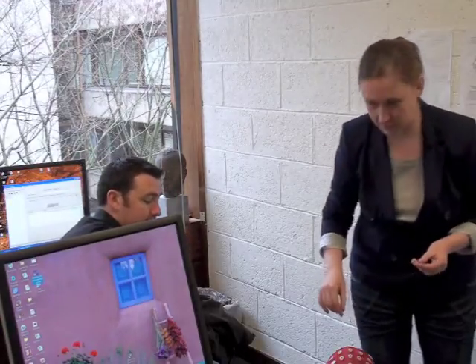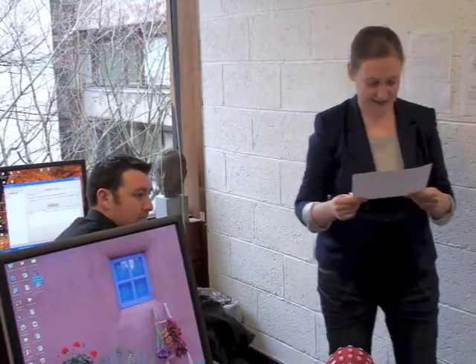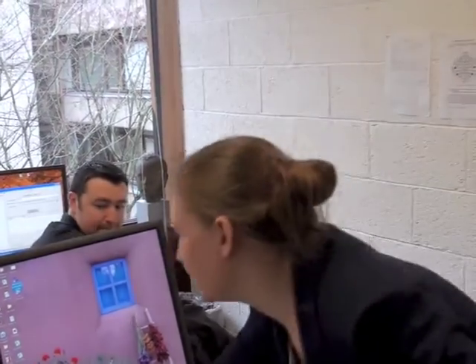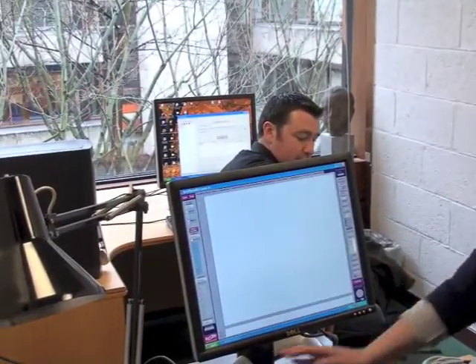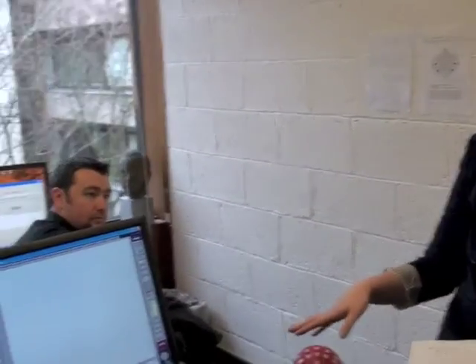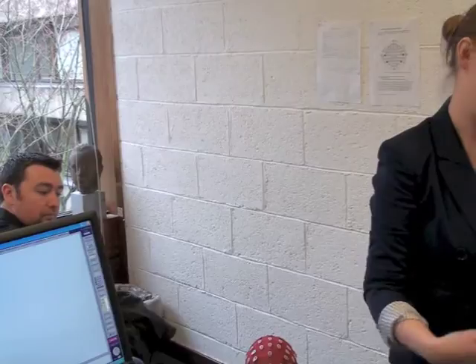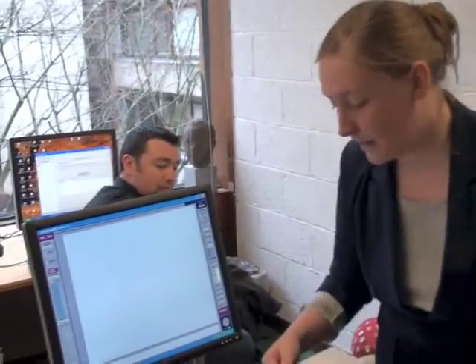So, where did I put my sheet? Here it is. Okay, so I've measured Bren's head. What I do now is I set up, make sure Presentation and BioSemi are working. There's a program on your recording computer called ActiveView. It's from BioSemi, and if you have any questions at all about BioSemi or ActiveView, including the best way to run an experiment, they're really helpful and they'll tell you the best way to do things.